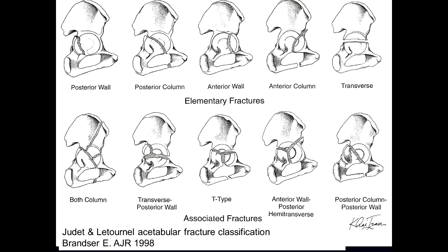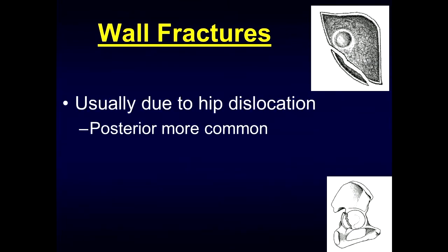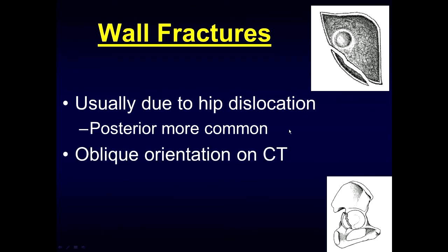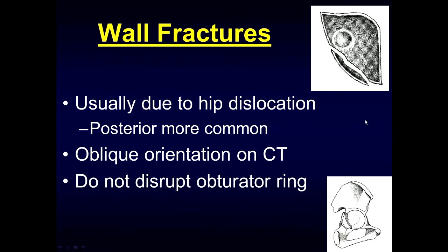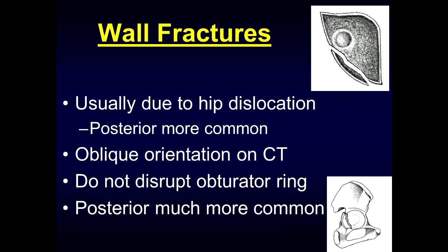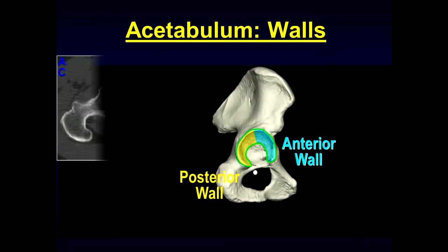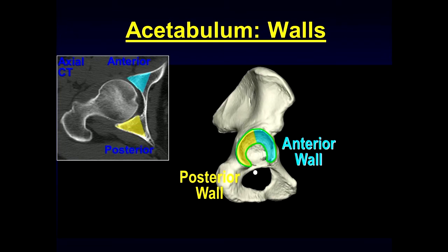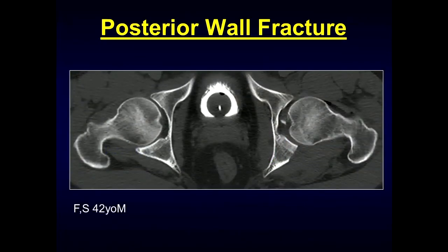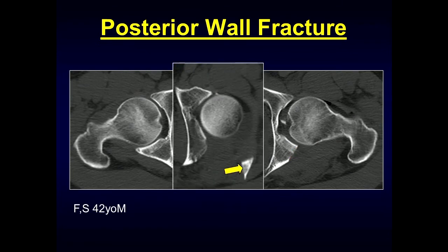Wall fractures are typically due to hip dislocations, with posterior dislocation being the most common. They have an oblique orientation on CT and do not disrupt the obturator ring. Posterior wall fractures are much more commonly encountered. On CT, we have our anterior and posterior walls, and in this individual who had a posterior hip dislocation, we notice the posterior wall is missing. On another acquisition, you can see the triangular shape of that displaced posterior acetabular wall.